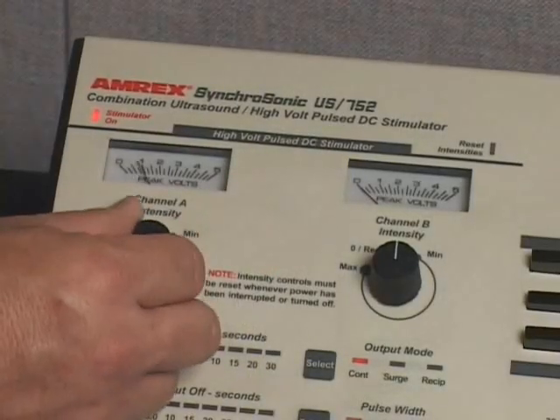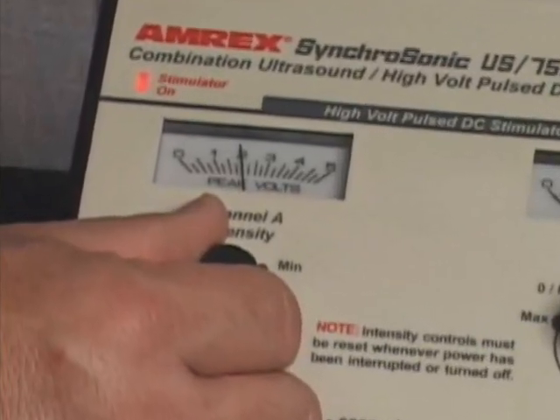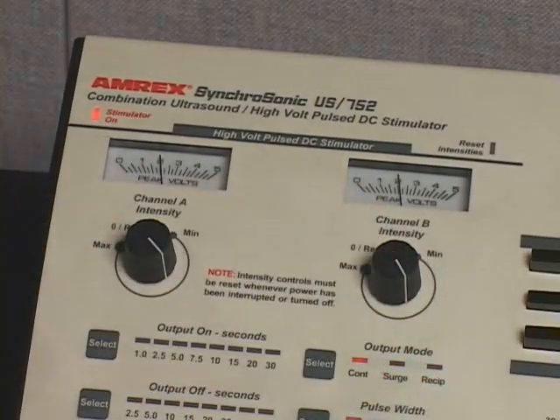Slowly increase the channel A intensity control to the desired output setting. The channel A intensity meter will indicate the output intensity selected. Slowly increase the channel B intensity control to the desired output setting. The channel B intensity meter will indicate the output intensity selected. The output intensity setting can be changed at any time during treatment.